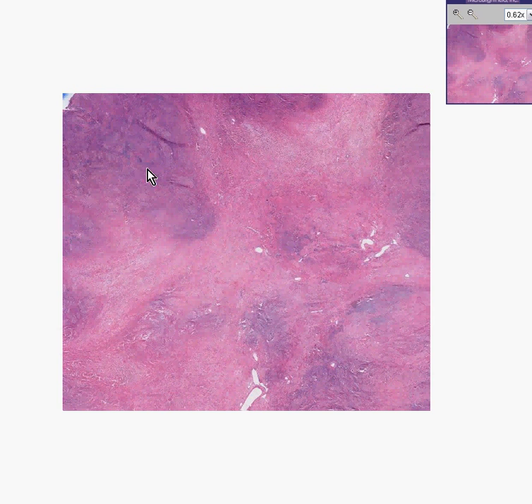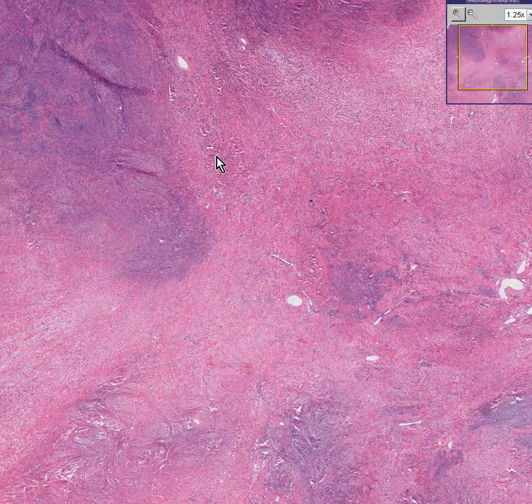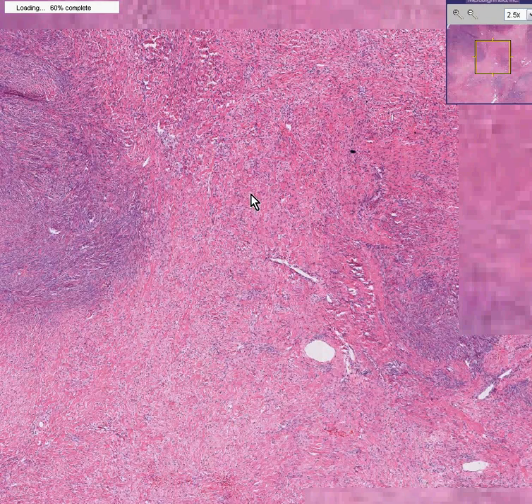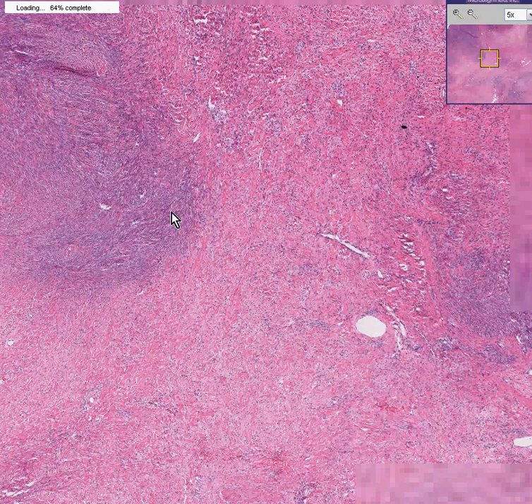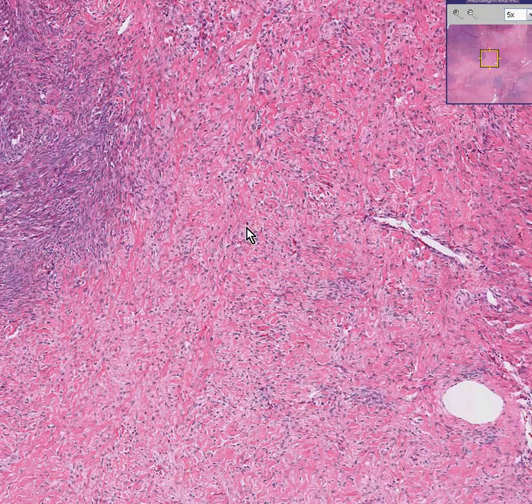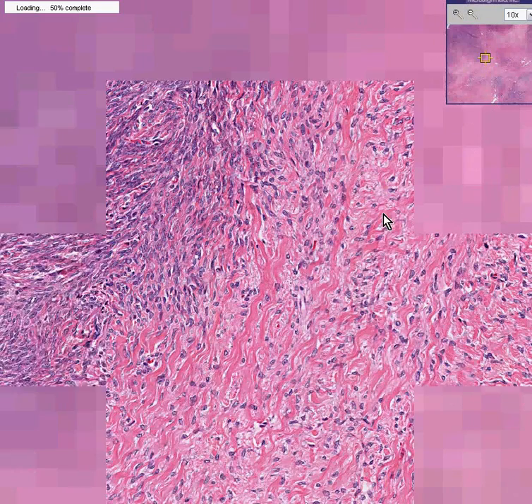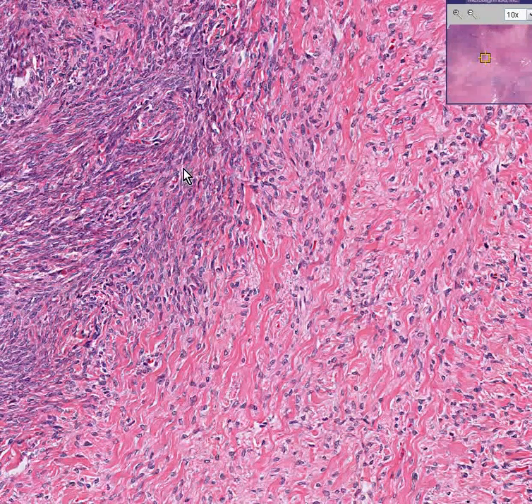So whenever you see a tumor of the ovary, which this is, which looks primarily like it's composed of connective tissue — this pink area — you would have absolutely no doubt recognizing this as looking almost like slam dunk classical normal fibroblasts and collagen, because that's what it is. But in this area as well, the bluer area, you can see the cells are spindly. They don't look like fibroblasts like you see out here. They are a little bit larger with nuclei, and they don't secrete or make collagen.